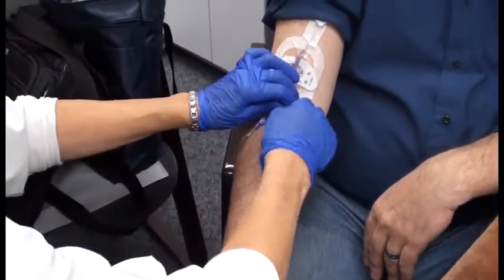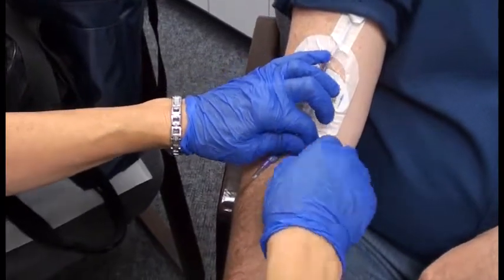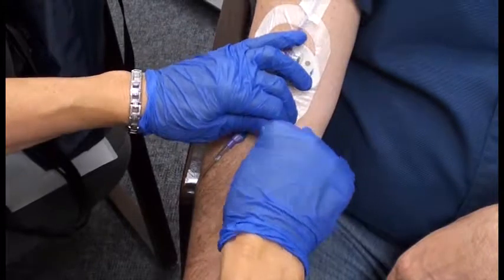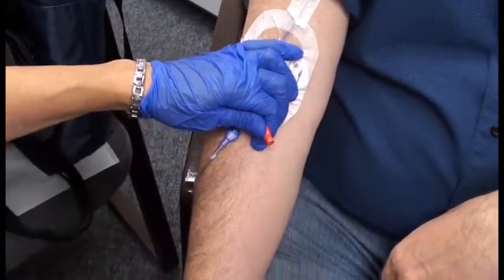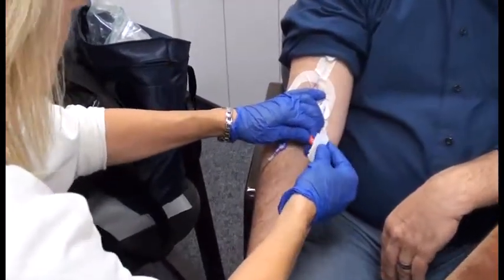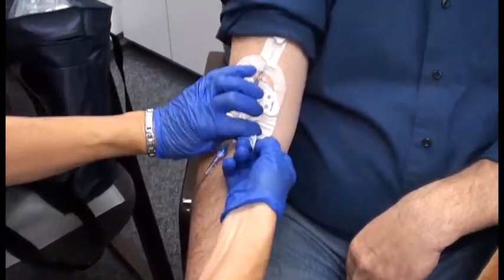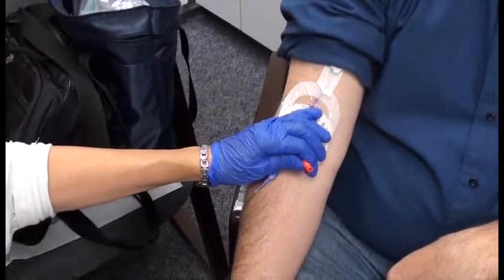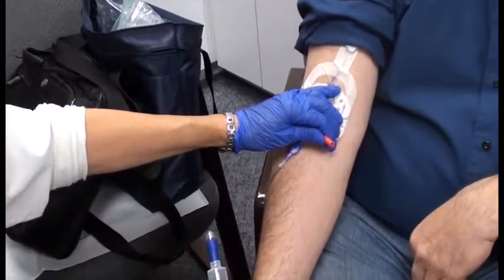I'm going to take off the cap, just in case there's been any dust there. Use a new wipe, again for 5 good wipes, and let it dry. It's kind of important to let it dry here.